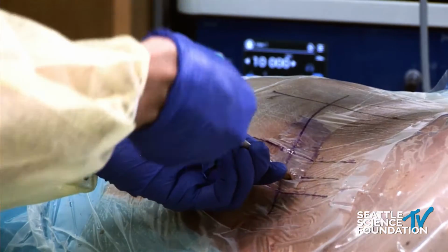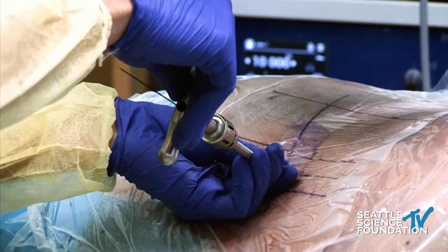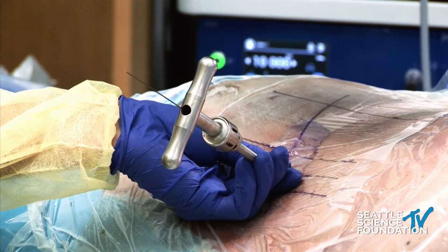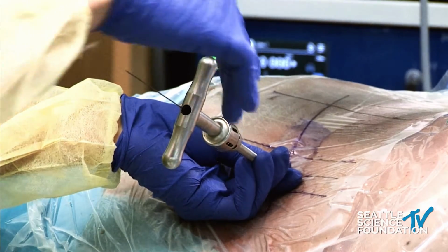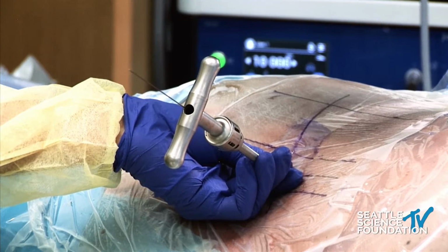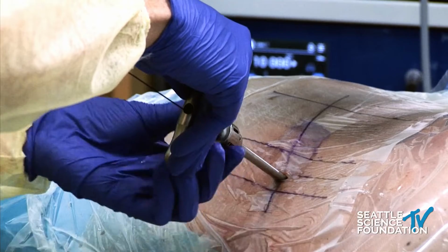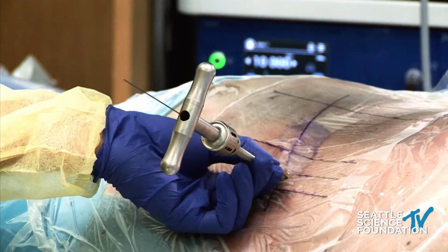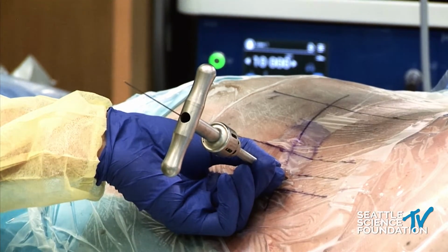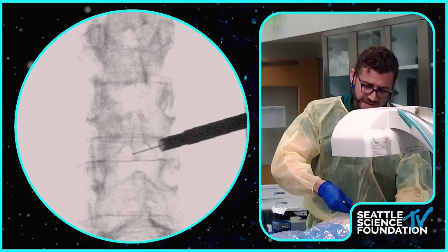All right, so if you could do an AP shot there, please. Okay, so you could see here all our dilators made it to our perfect starting point, which is the medial pedicle line. My reamer didn't make it all the way. That tells me that there is some SAP, some deep SAP, some maybe pedicle that's in the way. So in this situation, with this reamer, you want to err on reaming dorsally and inferiorly to get as much of that rim of bone as possible. So I'm going to err dorsally and inferiorly to ream this area.